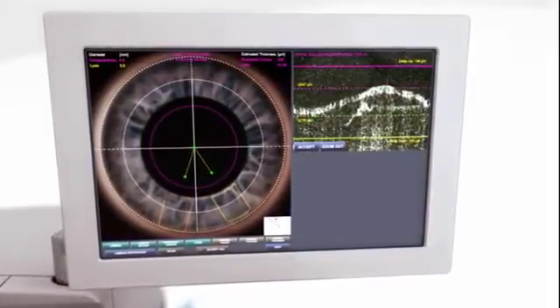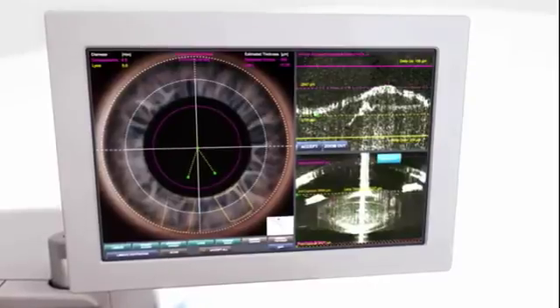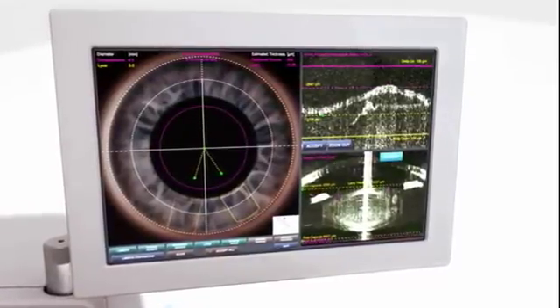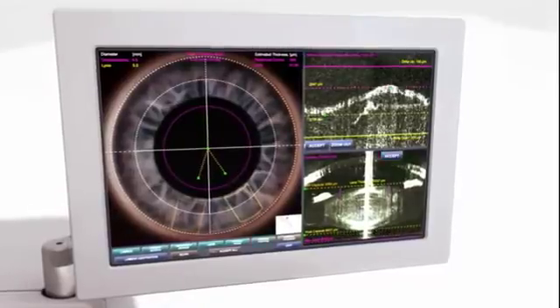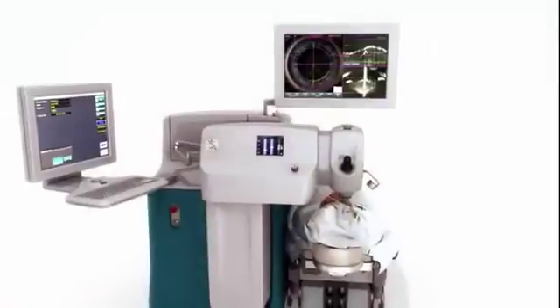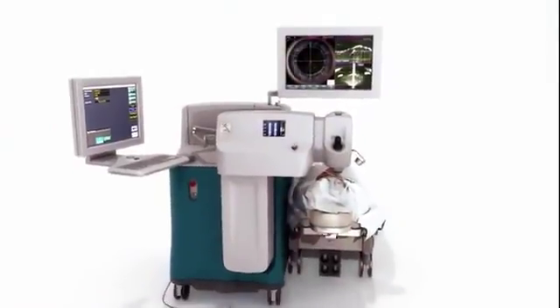Featuring intuitive graphic user interface, a wide range of laser settings can be easily adjusted before and during surgery. These include size, shape, and location of each incision, lens fragmentation, and the depth of cuts.